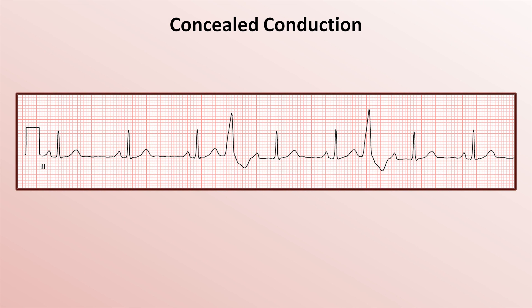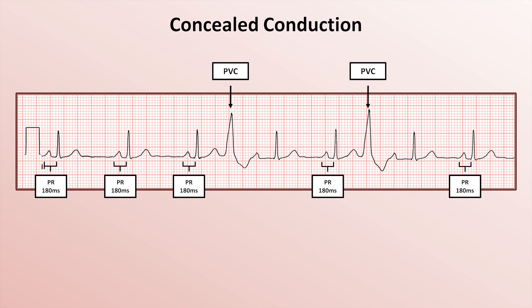First, consider this rhythm strip. We have what appears to be normal sinus rhythm with a rate of 60 beats per minute, and there are two PVCs. These are a special kind of PVC called an interpolated PVC, which means that it occurs early enough after the preceding sinus beat that the subsequent sinus beat is still conducted — in other words, there is no large disruption of the underlying sinus rhythm. However, look carefully at the PR intervals. For most of the sinus beats, the PR interval is about 180 milliseconds. However, for the sinus beats that come after the two PVCs, the PR is longer, about 310 milliseconds.